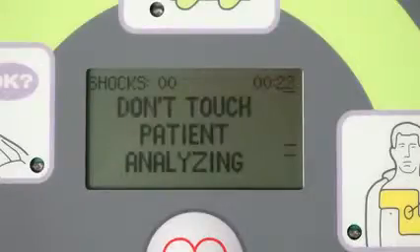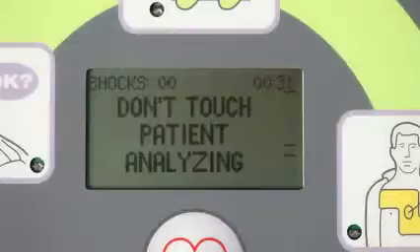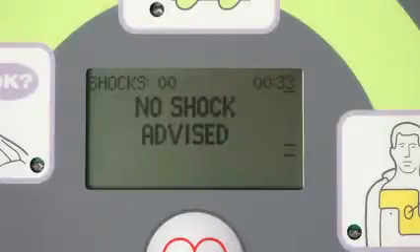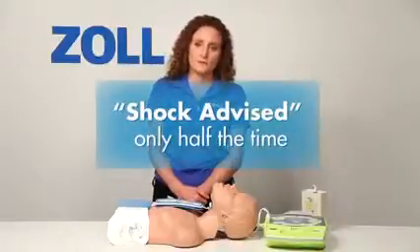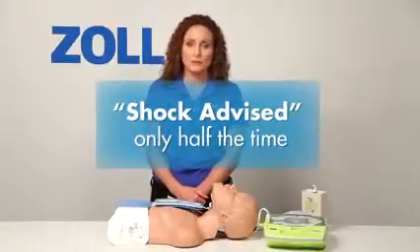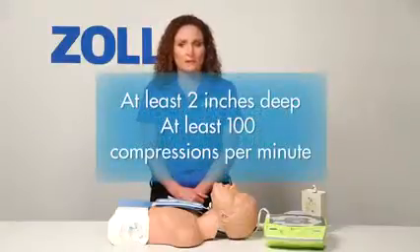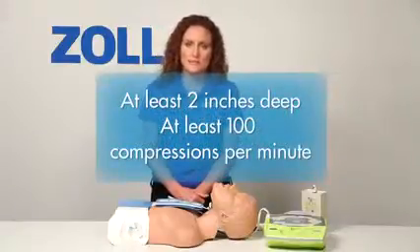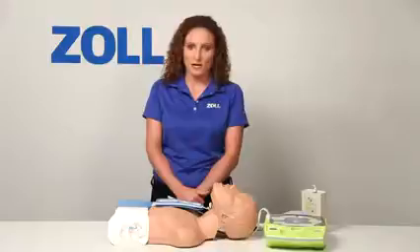Don't touch patient. Analyzing. No shock advised. Start CPR. Half of all rescues with an AED start with no shock advised. Perform good CPR with chest compressions that are at least 2 inches deep at a rate of 100 compressions per minute, and the next analysis may tell you to deliver a shock.